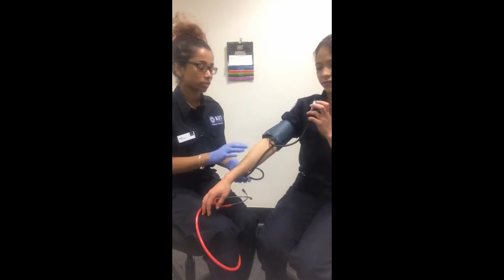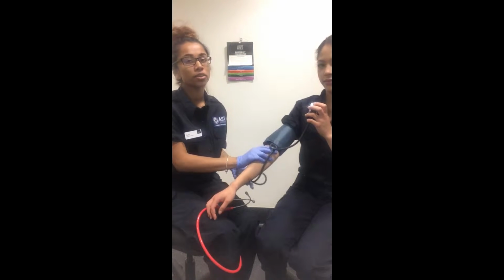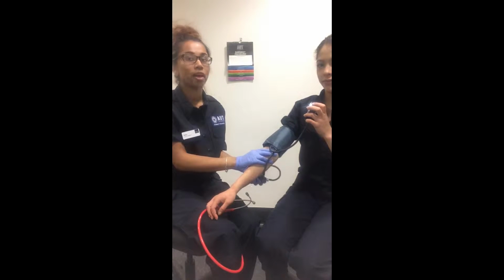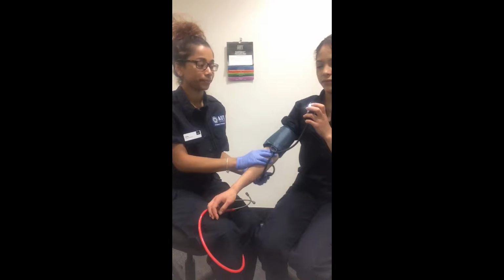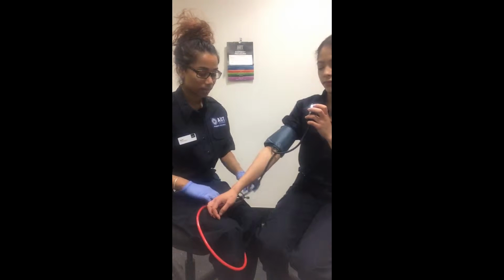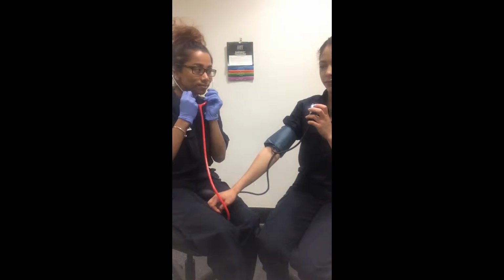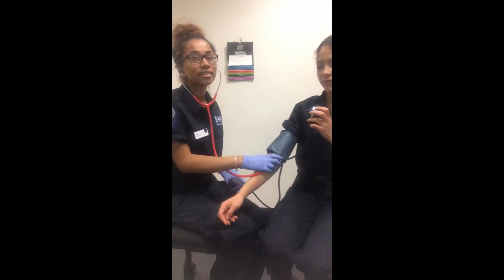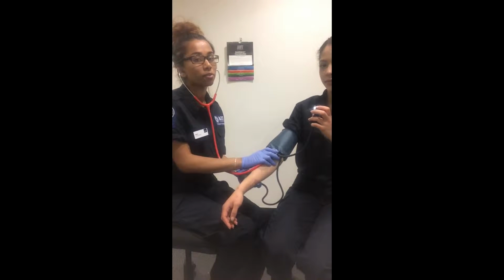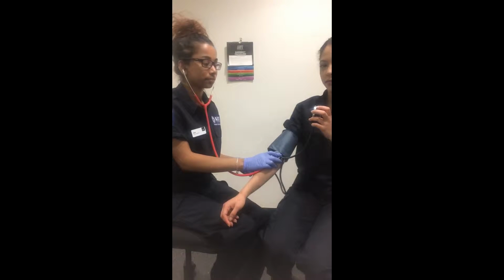So you want to locate the patient's brachial pulse, which is on the medial side of the arm. Once you've located this, you want to inflate the cuff till you can't feel the pulse any longer. Once you can't feel it anymore, just give it one more squeeze and then take your stethoscope. Place the stethoscope on the medial side of the inner elbow over the point where the pulse was felt. You want to then slowly release the pressure till you hear the heart sounds.